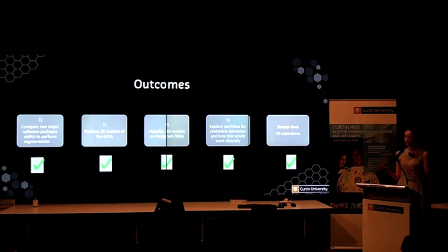I used two different software packages and I was able to compare which one was better, because ultimately the idea is this would be used in the clinical setting and it needs to be easy, seamless and quick to use. So I looked at the software and which one was better in these regards. Secondly, producing the 3D models of the aorta, which I'll show you on the slides and you'll also get to see in the hologram table.